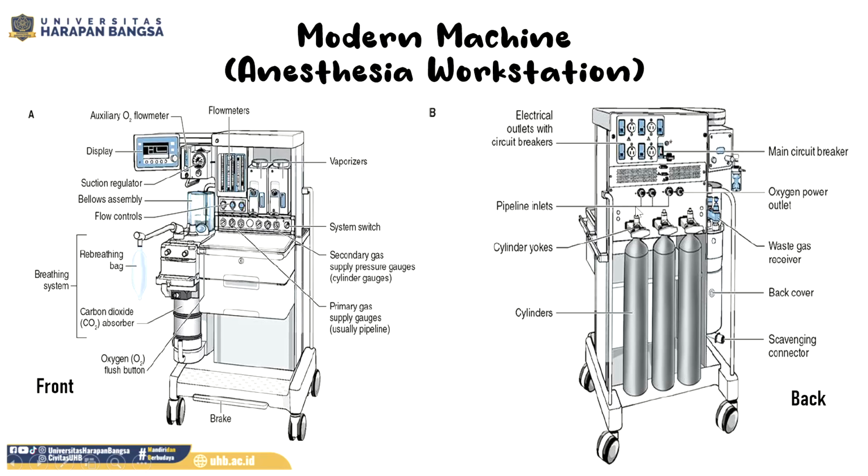And these are pipeline inlets. And the next is the waste gas receiver. And here we have cylinder yokes. And these are cylinders. And this is the scavenging connector.